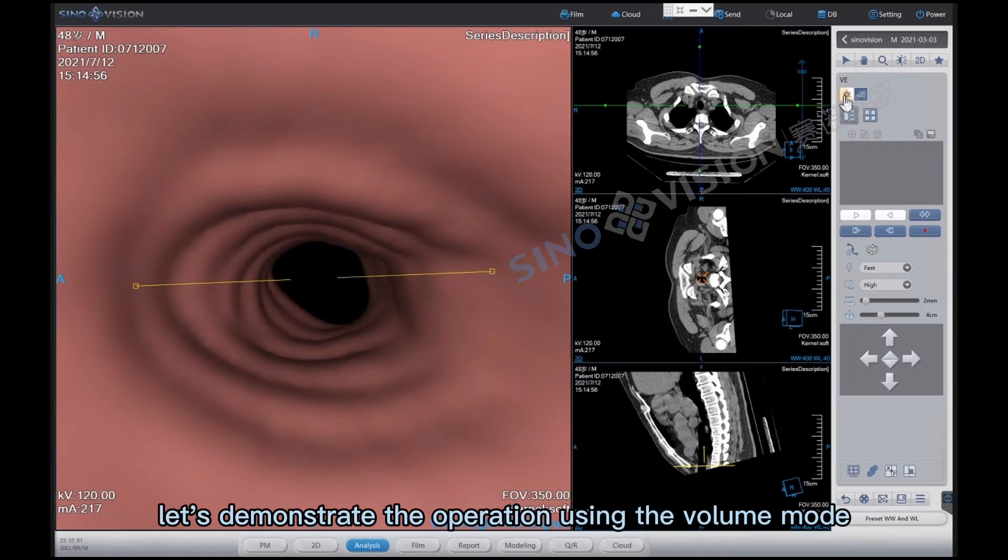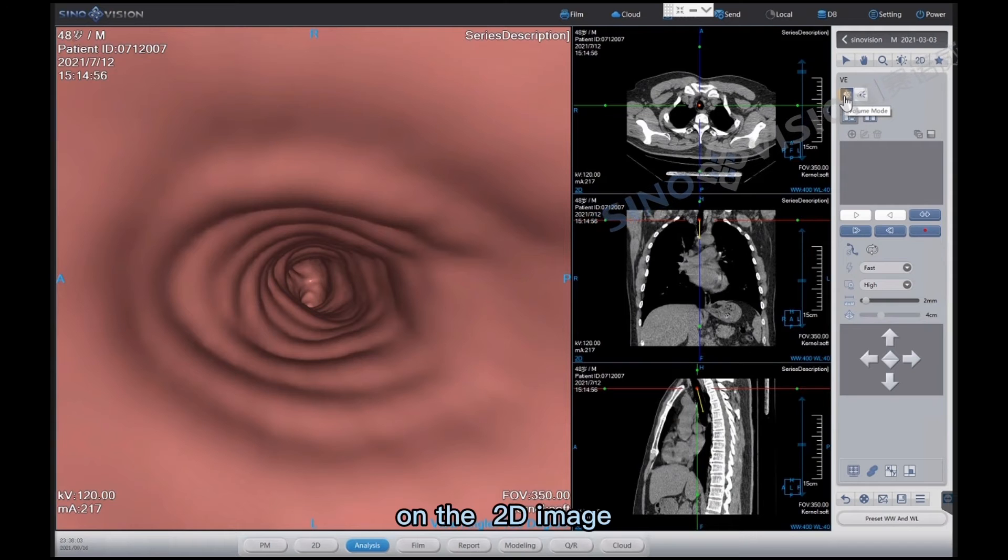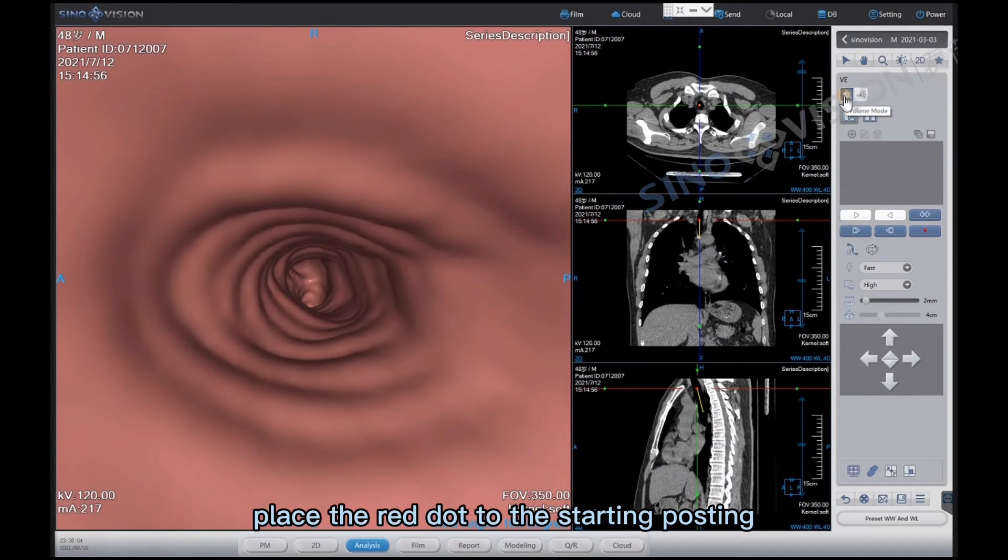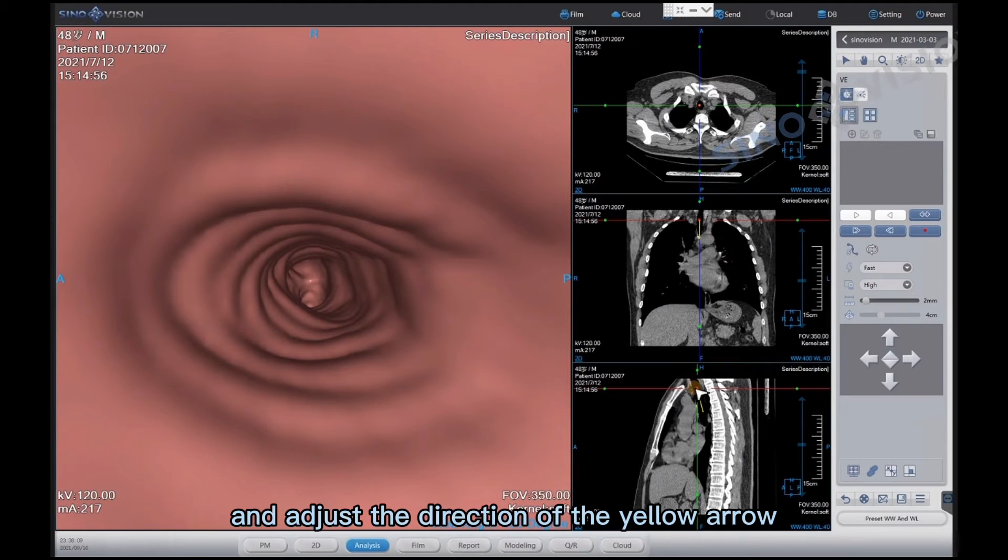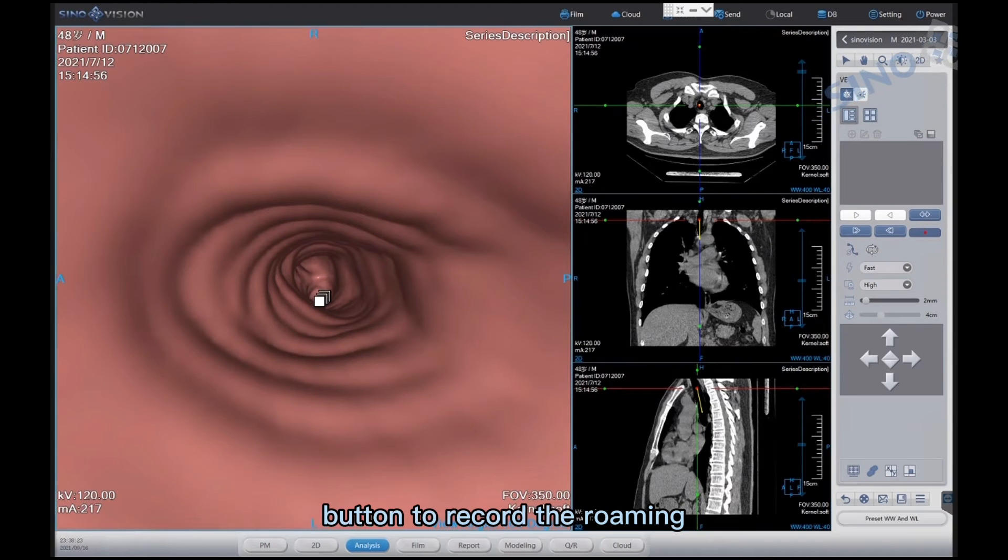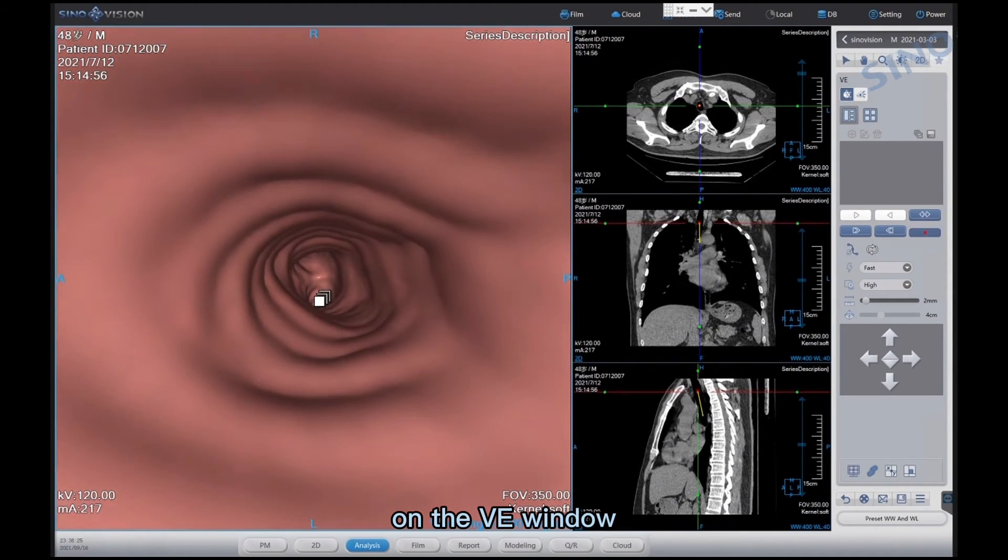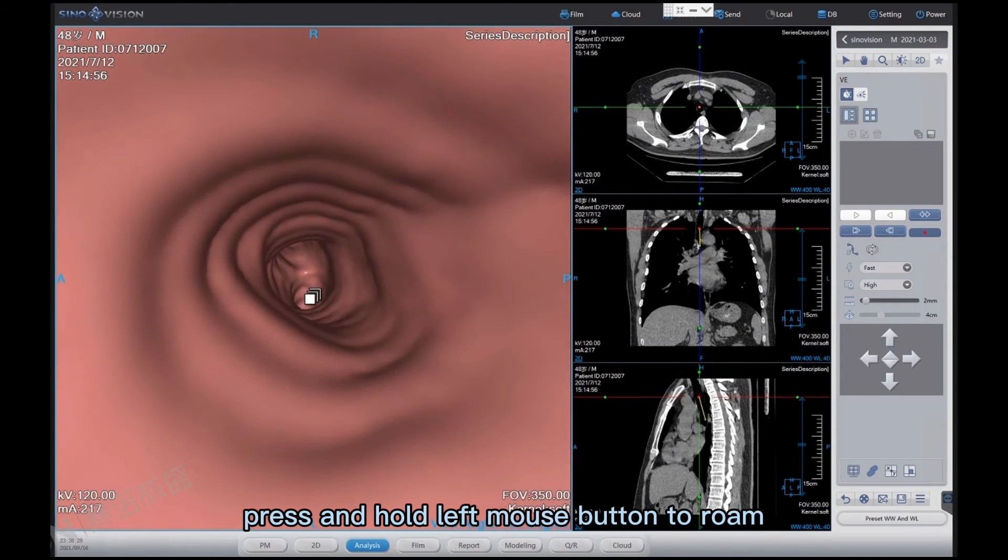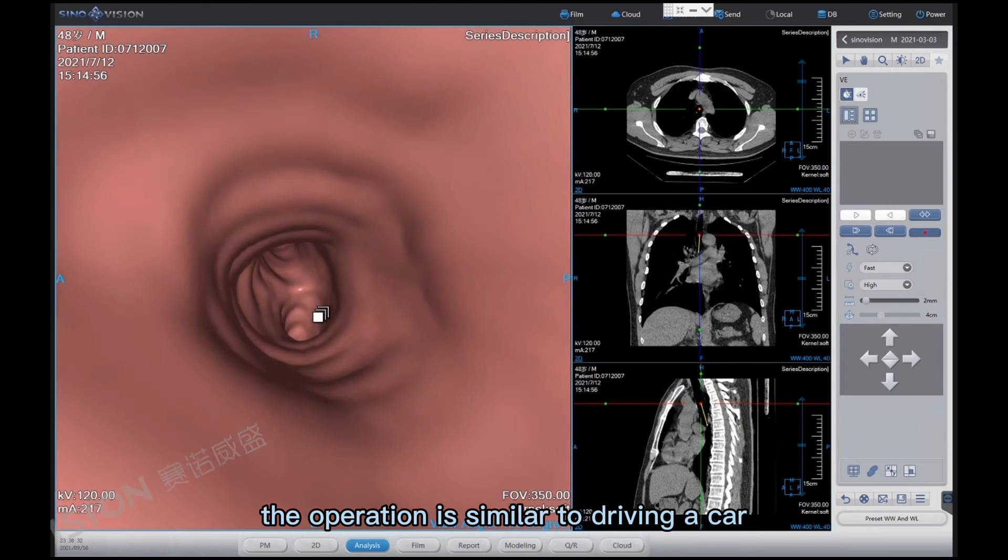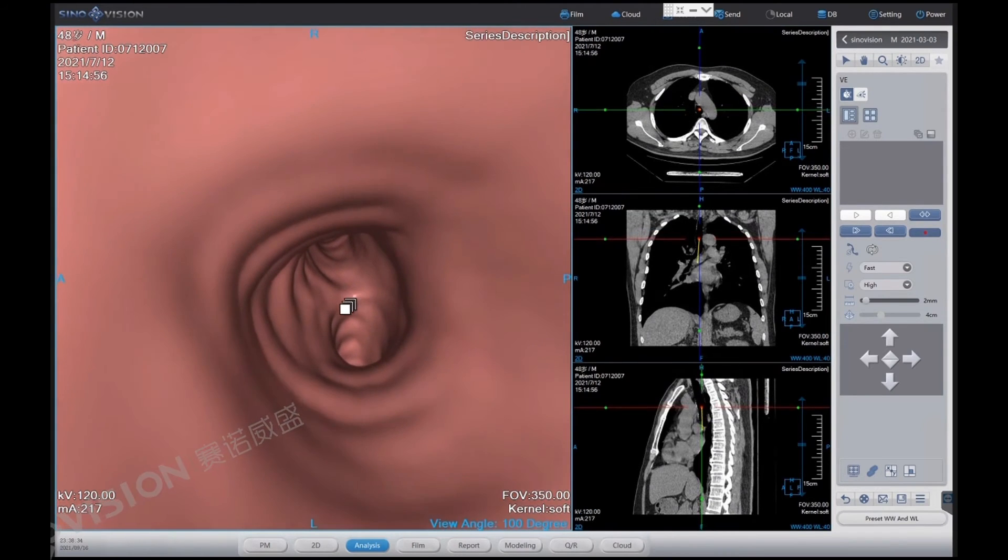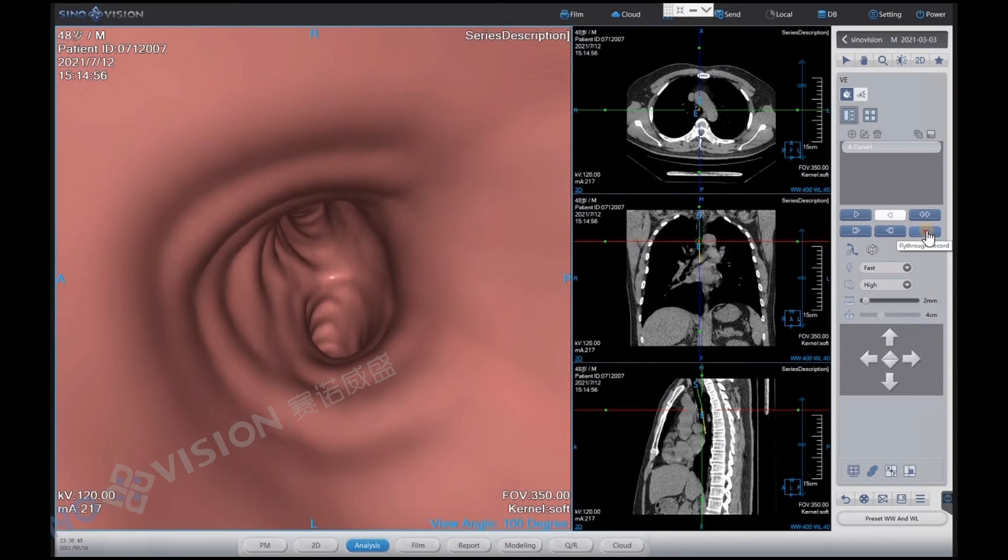Let's demonstrate the operation using the volume mode. On the 2D image, place the red dot to the starting position and adjust the direction of the yellow arrow. Click the fly through record button to record the roaming. On the VE window, press and hold left mouse button to roam. The operation is similar to driving a car. Click again the fly through record button to stop the recording.